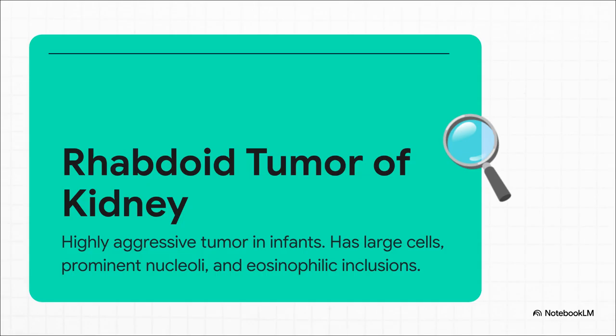For this one, it is all about the cytology. You're hunting for those classic rhabdoid cells: big cells that aren't sticking together, with wide-open vesicular nuclei, a single, prominent, almost cherry-red nucleolus, and these pink, globular blobs in the cytoplasm. Seeing those features is a major red flag.